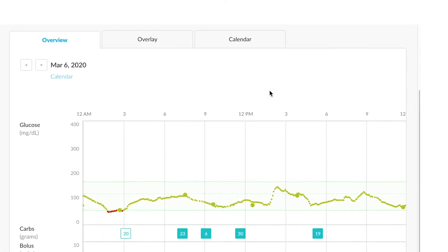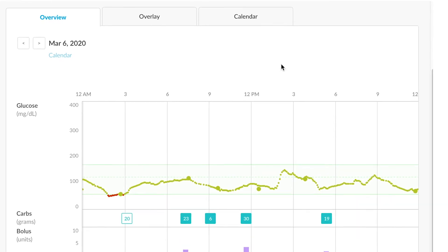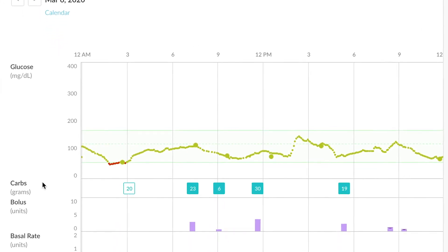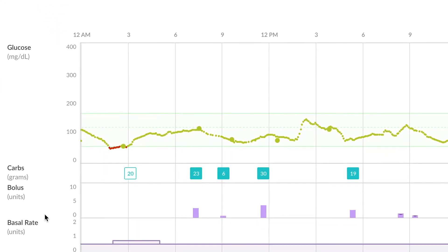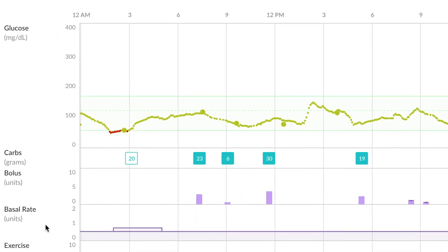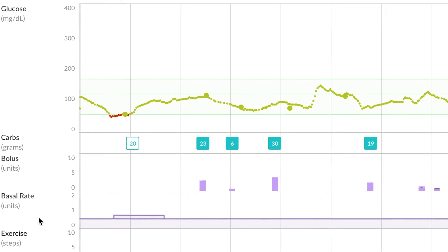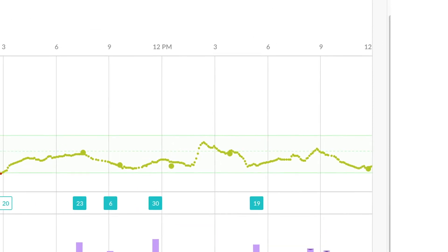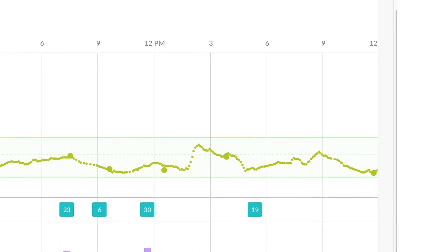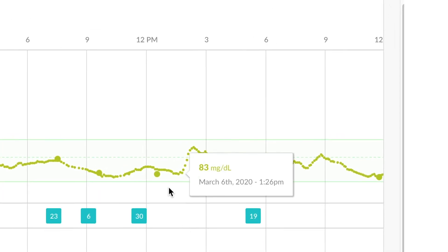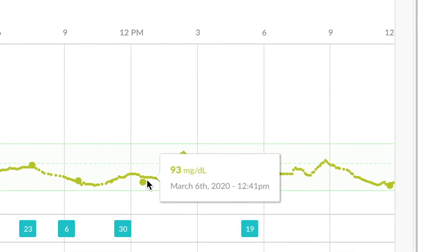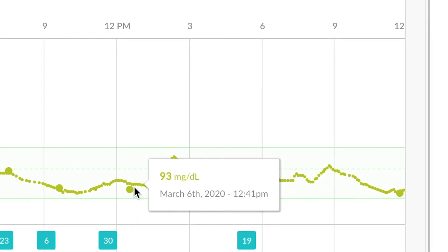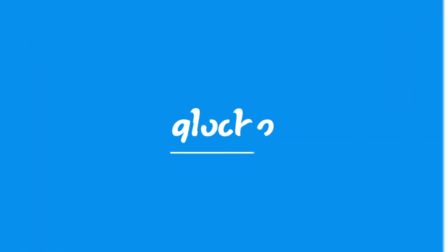This can be a great view to compare glucose, carbs, bolus, basal, and exercise data all in one easy place. Hovering over any one data point in the graph will display more information. For instance, here's a 93 blood glucose value.